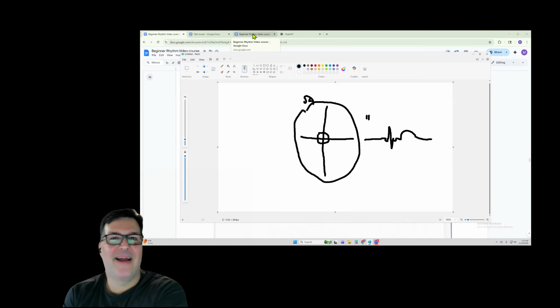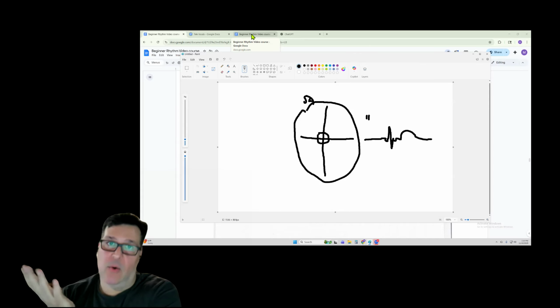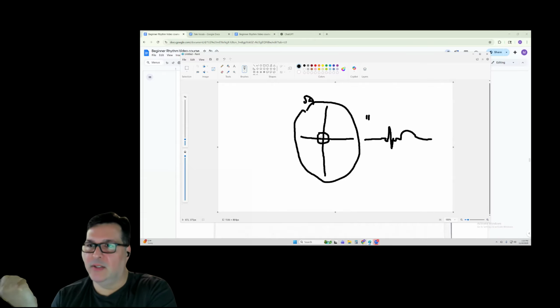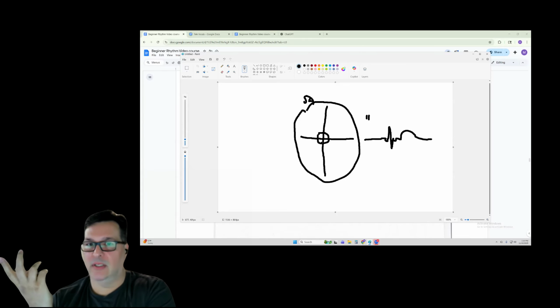I guess it's strange because I've always just thought that the P wave is going to be before. Right. So if we're talking sinus rhythms and atrial rhythms, absolutely. But we're now getting lower in the heart. Up here where the P wave is normally activated, it has that time of contraction coming down. Think of it as travel time. If the P wave is originating down here, it doesn't take as long to get down here. And so that's why it's really close to the QRS complex. If it's below here, the QRS is happening almost at the same time.